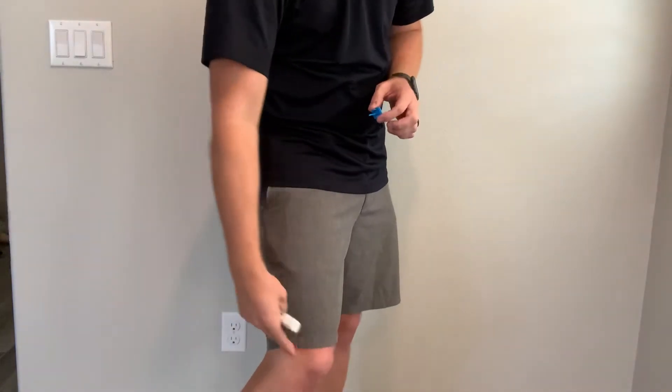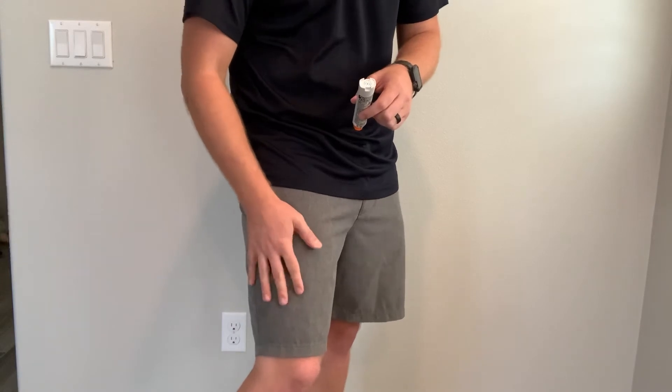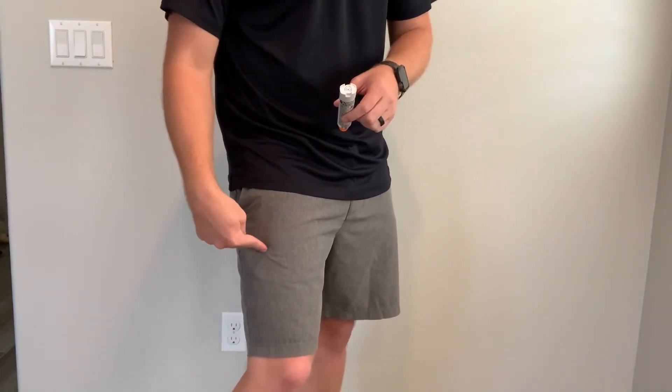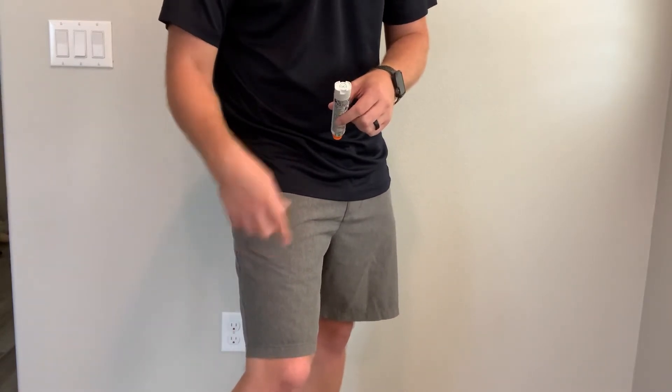I'm going to hit them anywhere in their outer thigh. One thing to check beforehand is make sure they don't have a phone or keys in their pocket, but it will go through any kind of pants or sweatpants. It will go through uniform pants as long as they don't have a football pad or something like that.